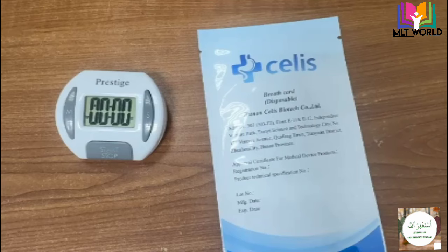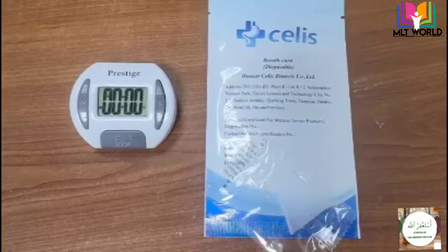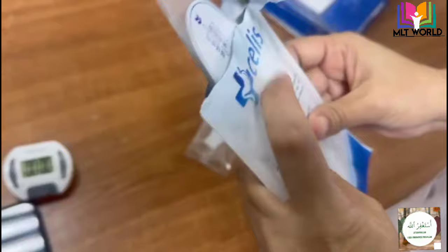After the completion of 15 minutes we will start the test. First, what we need is the card and this holder, which comes with the kit. I will open the card, attach the holder, and then tell the patient to blow air into the card.